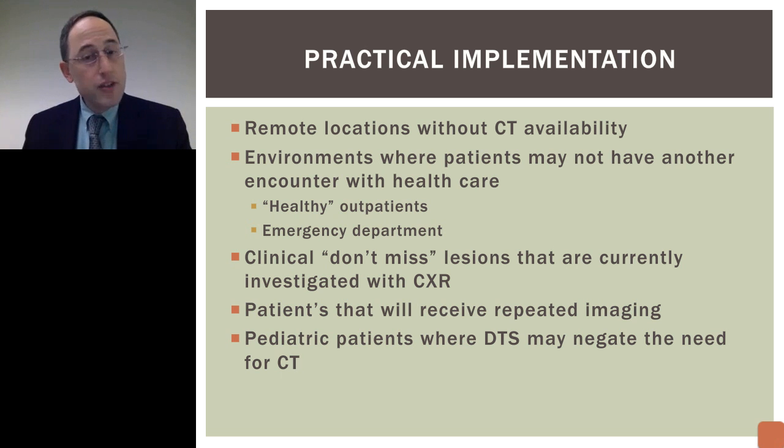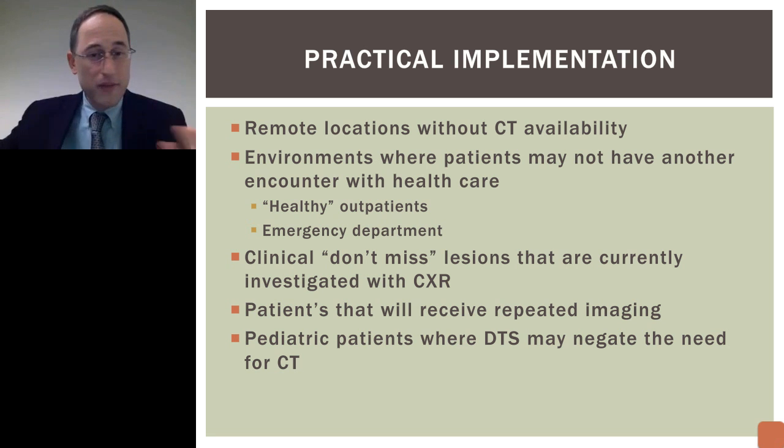Right? Any patient that will receive repeated imaging, and when I talk about this, I think say patients with cystic fibrosis, who are going to get chest X-rays and CTs for their whole life, they're going to live for decades, they may be better served by tomo.